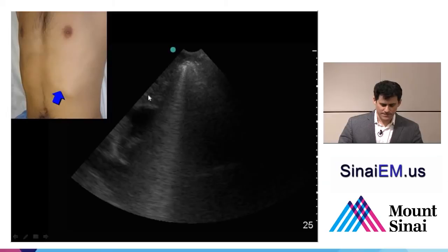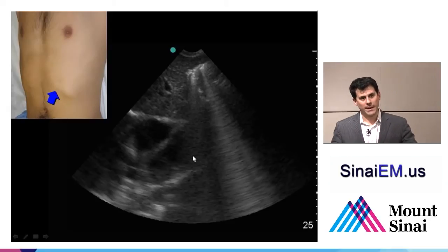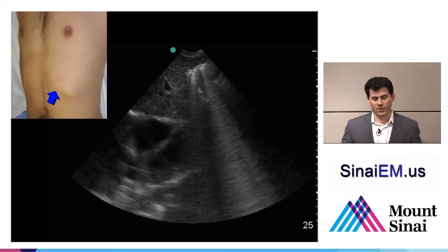This little sliver is just the tiniest hint of the liver, which is going to be more towards the patient's right-hand side. So if we move the probe to the right, we unmask more liver. You can get a better sense now that this area is stomach, causing that same reverberation artifact going down. And you start to see that there's liver echo texture here, there's a little portal vein here, there's some pericardium. You start to see the right ventricle, left ventricle. So we're getting a better view of the heart, paradoxically, by moving further away from the heart towards the patient's right-hand side, because we're using the liver as a window.